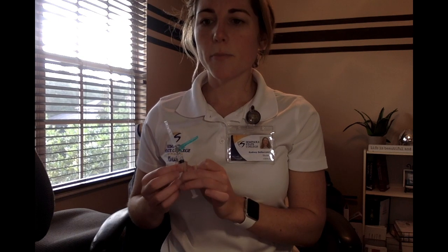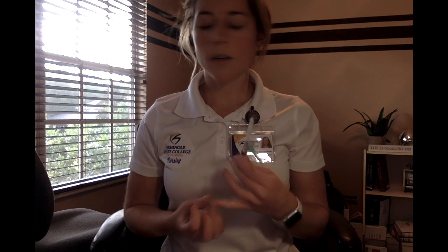Okay, so we gathered our equipment. I checked for the expiration. We know it's safe to give. We did the calculations, the second check. Okay, so now we labeled everything, so now we can go ahead and gather our stuff and head back to the patient's room. Again, knocking before entering, washing our hands, and then before we even touch the patient, we're going to go ahead and do our third check of the 6 rights.